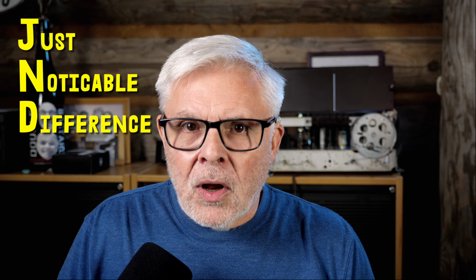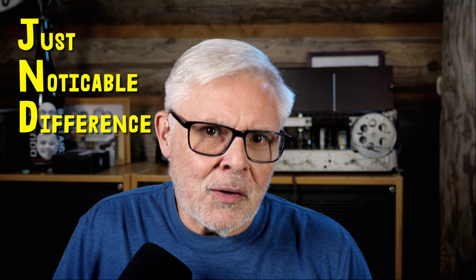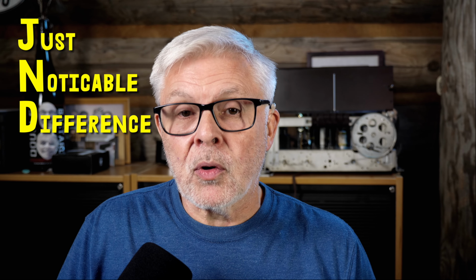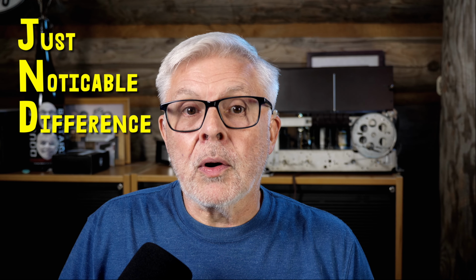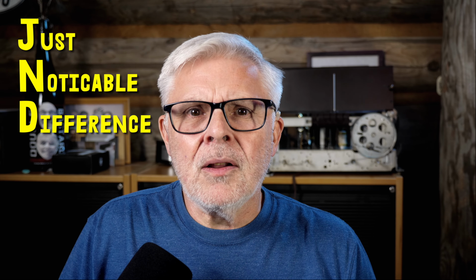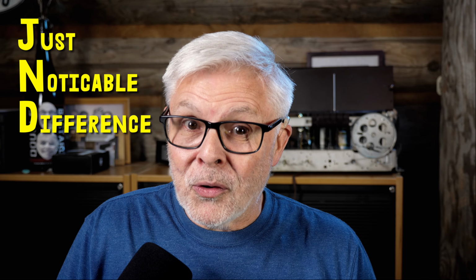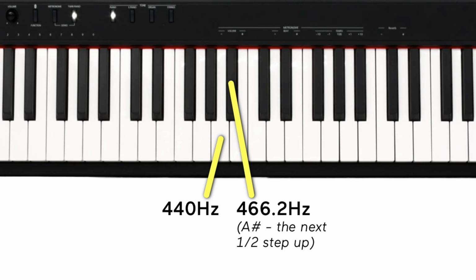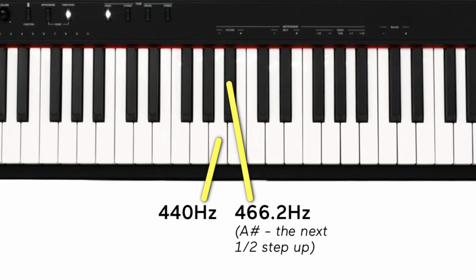Okay, some more lingo. JND, a technical term that stands for just noticeable difference. I know, I was expecting something more fancy than that, but it just refers to the smallest frequency change that the average person can detect. At lower frequencies, like for instance that 440 Hertz we've been talking about, the JND is only 0.3%. At 440 Hertz, that's just 1 1/3 Hertz. That means the average person can tell the difference between 440 Hertz and 441 1/3 Hertz. That's really not much of a difference.